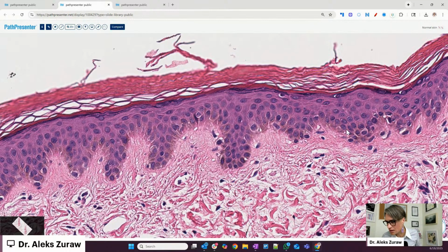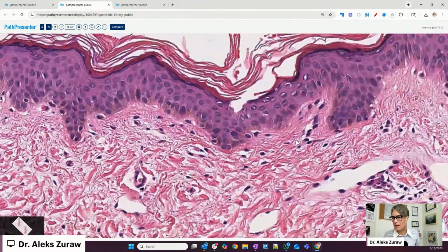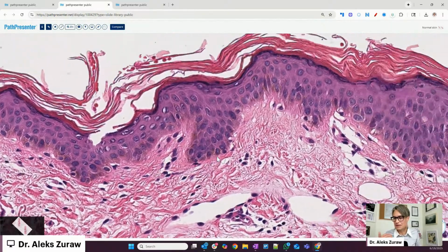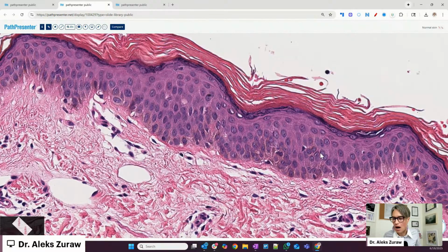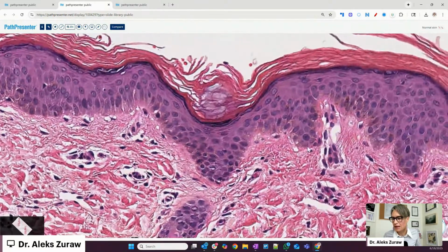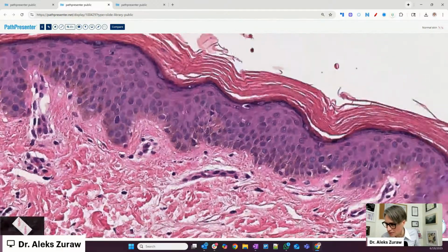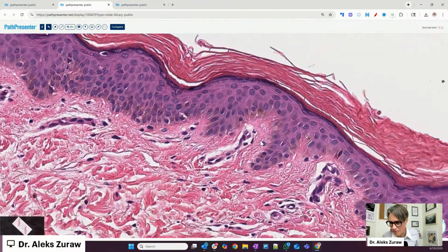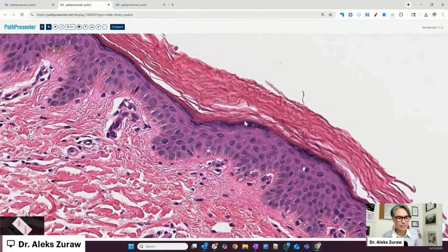And what we should see there are mitoses, because this is regenerating the skin. This is where the cells are growing, proliferating, dividing, so that we can have all this protection layer. I don't see any mitosis. Maybe later when you look at the slide.